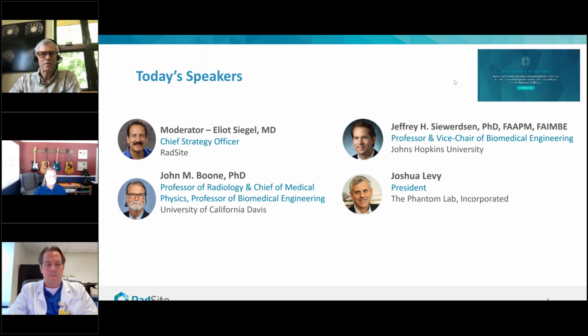And one thing that I think most people don't know are the really profound differences in some of the metrics that one might use to describe things as simple as comparing radiation dose with cone beam versus non-cone beam, or being able to evaluate image quality, or even to talk about relatively straightforward concepts such as slice thickness that we take for granted in CT when we try to apply it to cone beam CT.